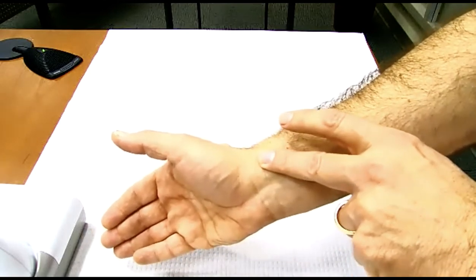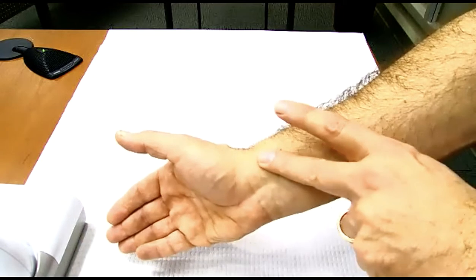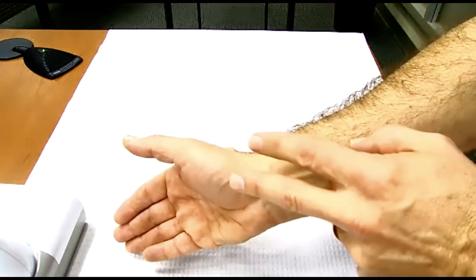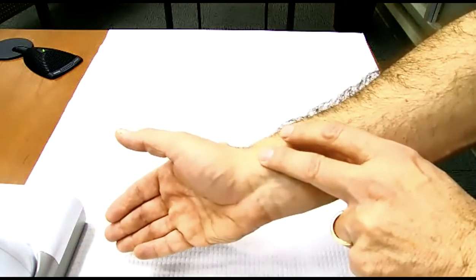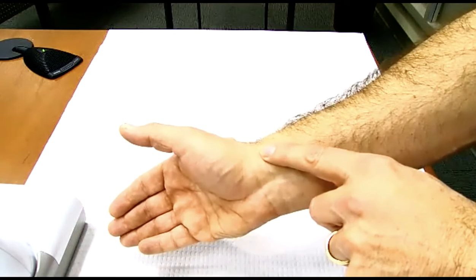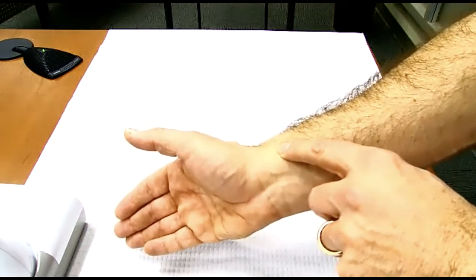Although I did have a student yesterday who could not feel it with the middle finger, but could feel it just fine with the index finger. It may have to do with some sensitivity between your fingers. Ideally, try to do it with your middle finger. If you're having some problems while learning how to do it, use your index finger for now, but realize it's best to avoid that.